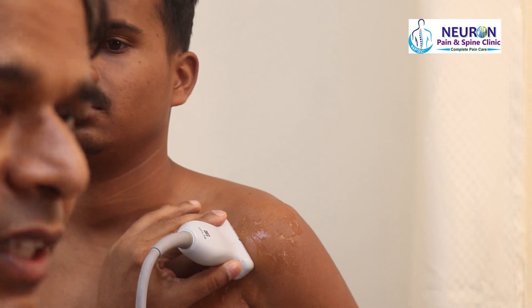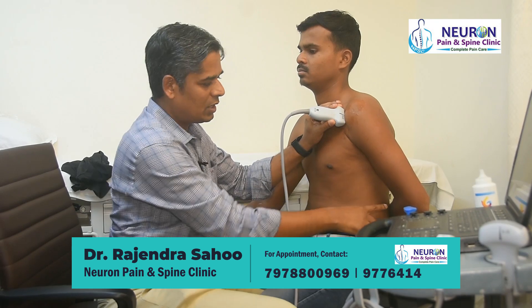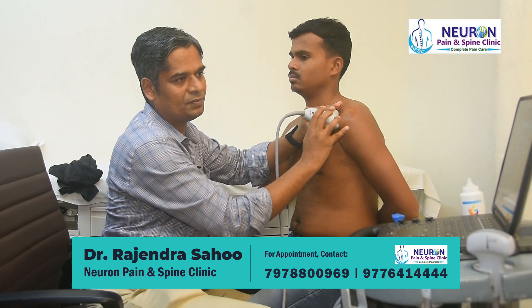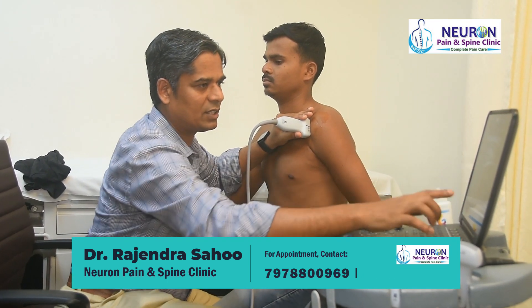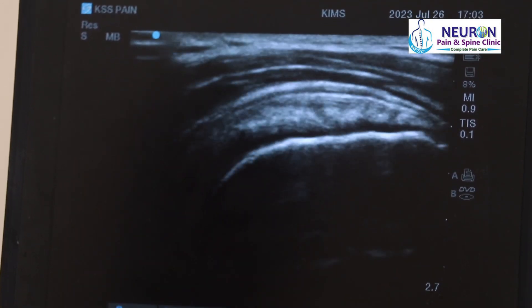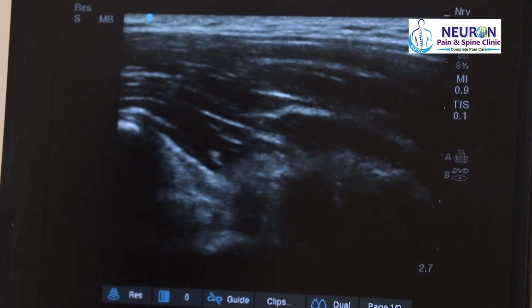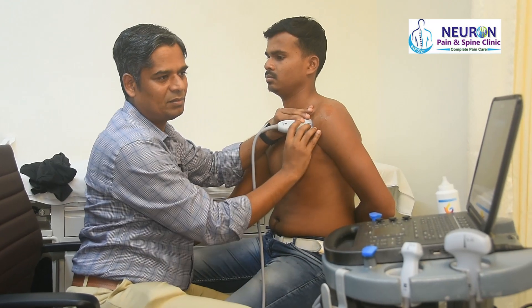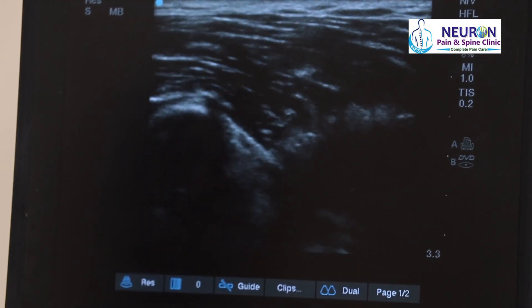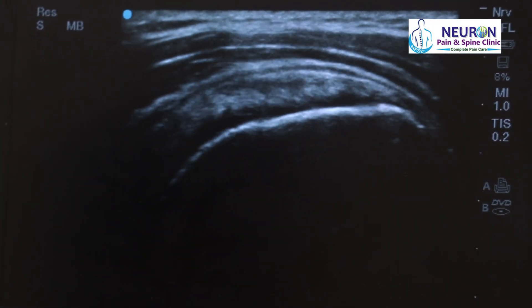Now I'll show the difference in the cross position. This was the modified cross — now the arm is in extreme internal rotation. In the cross position, the supraspinatus tendon is very well seen, but as I slide the probe anteriorly, I cannot see the biceps tendon because it is hidden due to the extreme internal rotation. That is the key difference between the modified cross and the cross position.